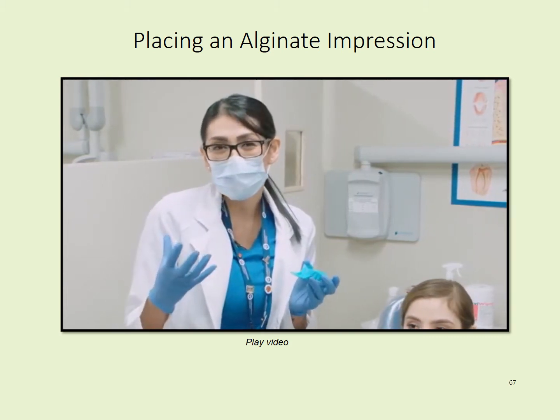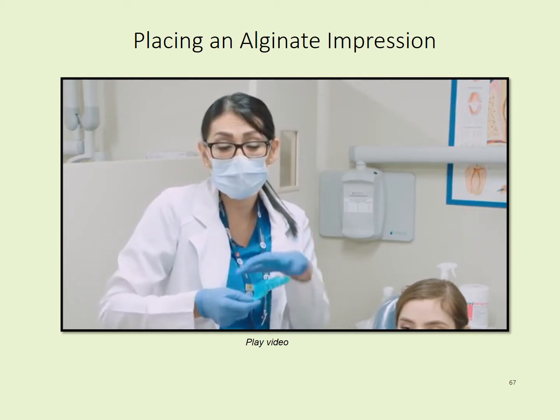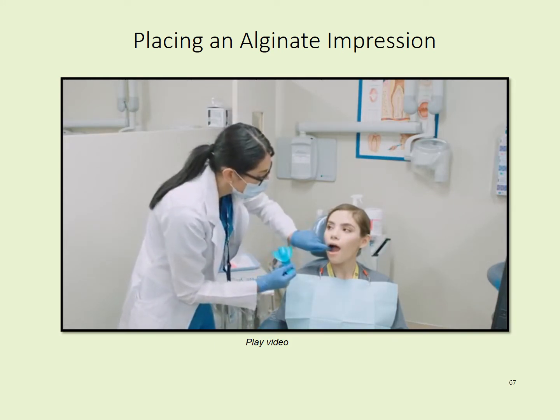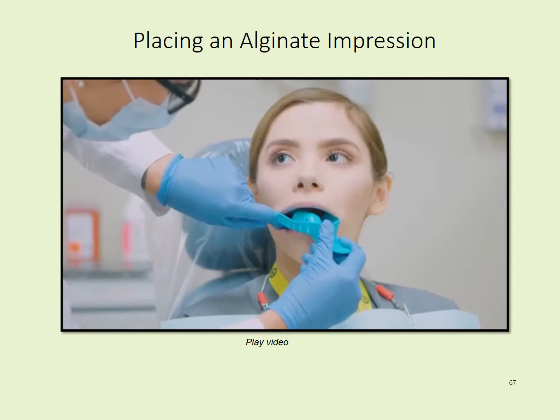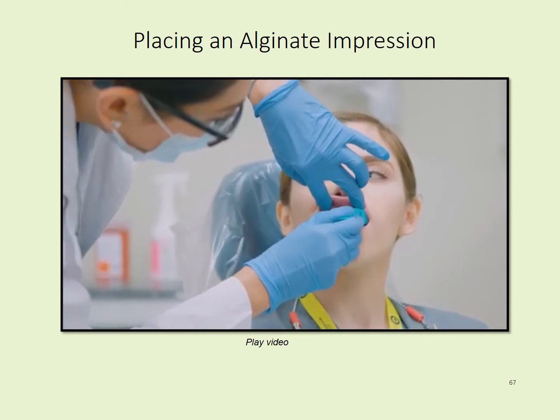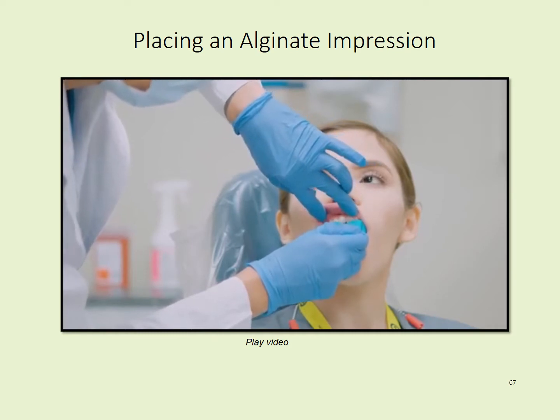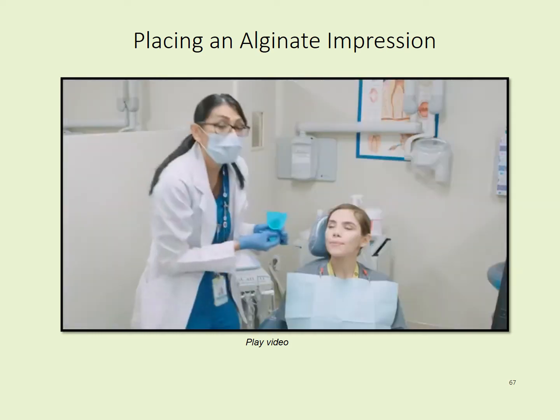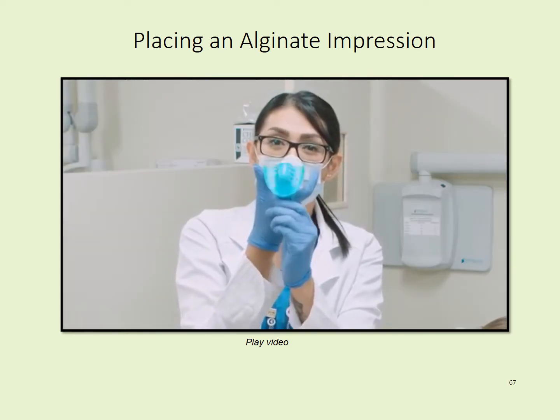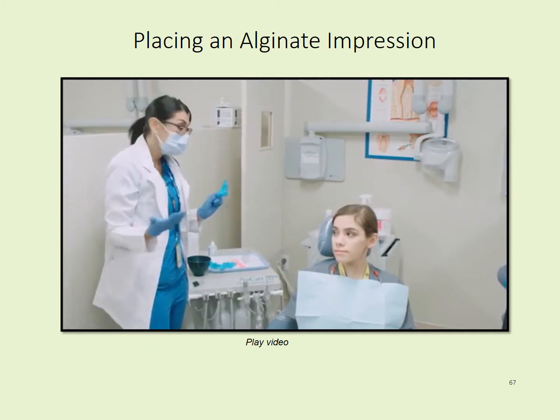When we place it in the patient's mouth, what we're looking for is comfort. Is it going to pinch their cheeks, pinch their gums, rub against their teeth? Does it even fit in the arch to be able to capture the whole entire mouth? Please open. I'm going to use my finger to retract her cheek, and I'm going to swoop in the tray like so. Open big. And then I'm going to lift her lip and try this tray on. Now, open please. I feel that this tray can't go all the way inside her mouth because her arch is too big. So if here's our tray, the patient's arch is kind of like this and the tray's not going down all the way. So that lets me know that I need to try on a different tray.